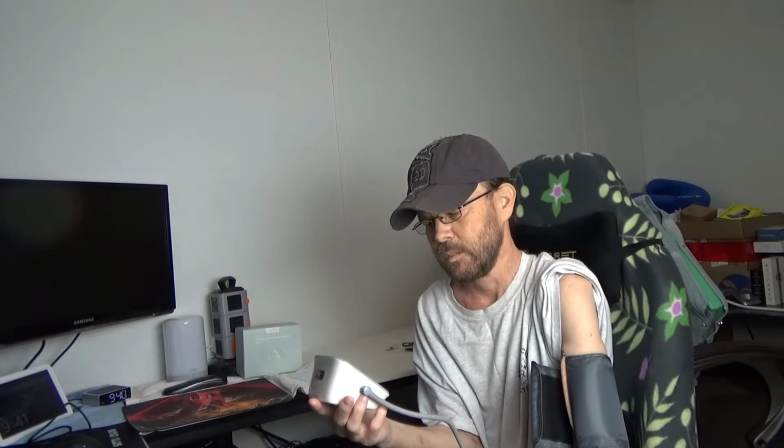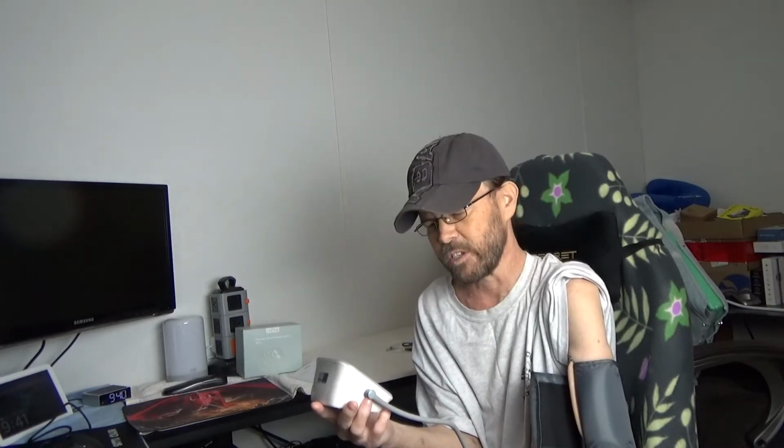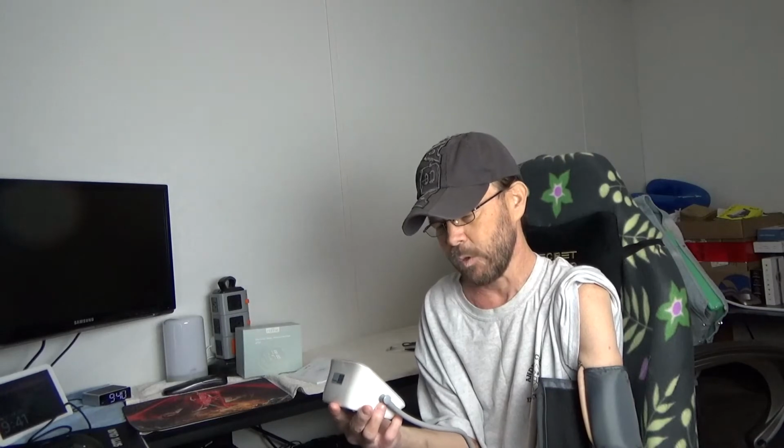Push the start button, and you can probably hear that. Very quiet. But you can see the readout. I haven't even set the time on it because I'm going to pull the batteries out. Might order a power adapter. So it's taking the measurement now. I'm sure speaking is not helping.